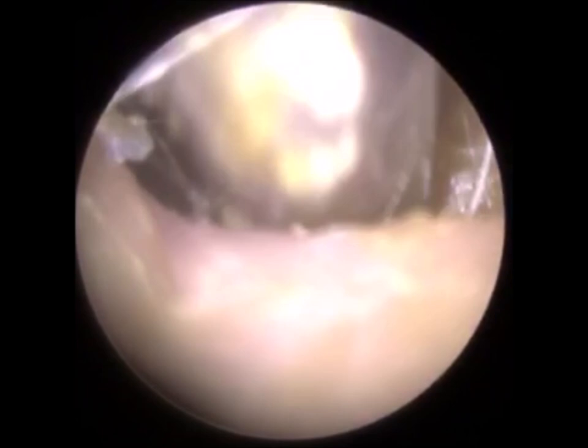And you will notice when the ear is a bit damp and there's a bit of blood, it does make the view a bit blurry. I can still see exactly what I'm doing, but it does cause a bit of blurriness. So on occasions I will come out and use an alcohol wipe to clean the distal end of the endoscope. The distal end is the tip, the bit that we insert inside the ear to obtain the view.